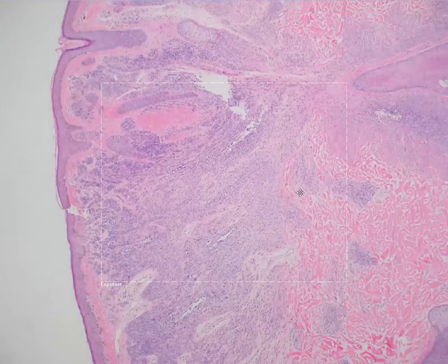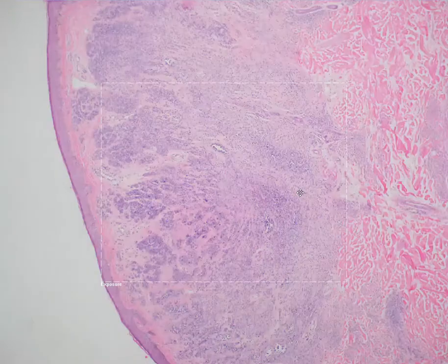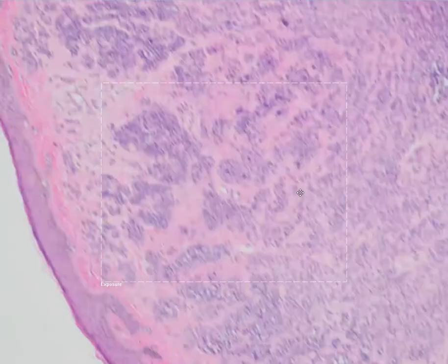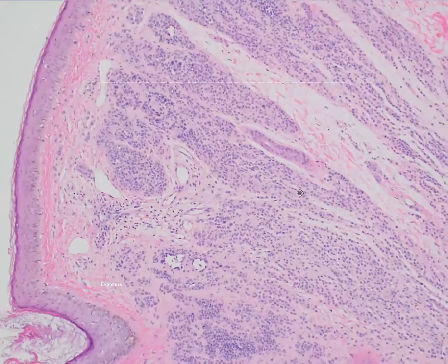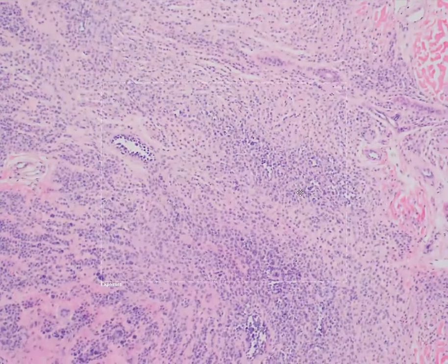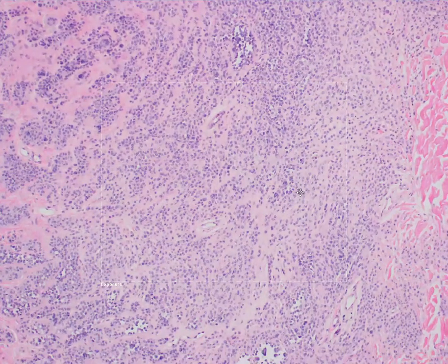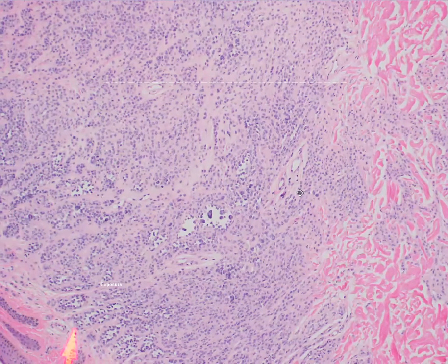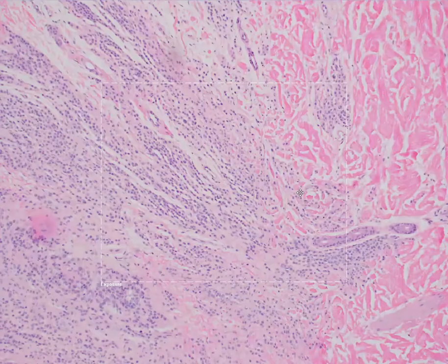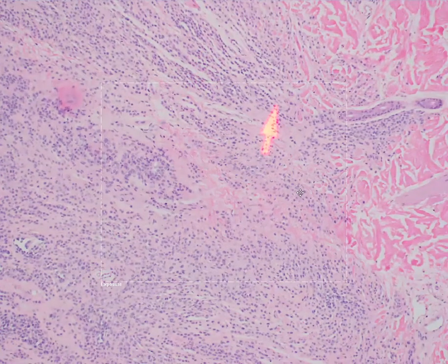Here is an example of a very typical dermal nevus. This is a punch biopsy down to the superficial subcutis, and we have a proliferation filling the dermis. At the superficial part of this proliferation, the constituent cells are organized in a nested array, and as they descend into the dermis, these cells start to break apart into single cells. You will also see certain areas that represent pseudo-vascular spaces, which you can sometimes see within nevi.